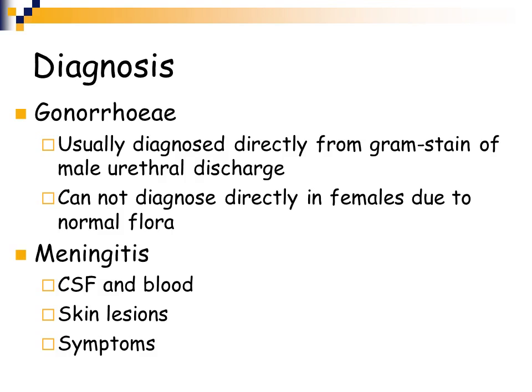Some of the normal flora in the female genital urinary tract look very similarly to Neisseria gonorrhea. You can see gram-negative cocci and even diplococci in a female genital specimen. And so you can't automatically assume that it's Neisseria gonorrhea. So for males, direct smear, gram stain, you can diagnose Neisseria gonorrhea. Females, you cannot. You have to grow the organism up and do biochemical tests on it.